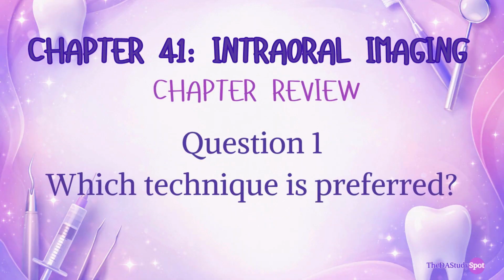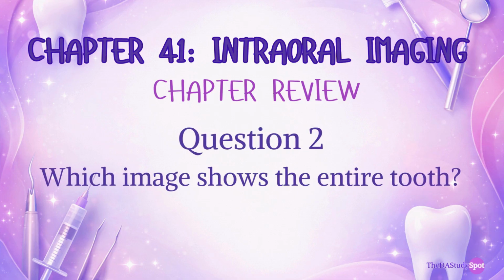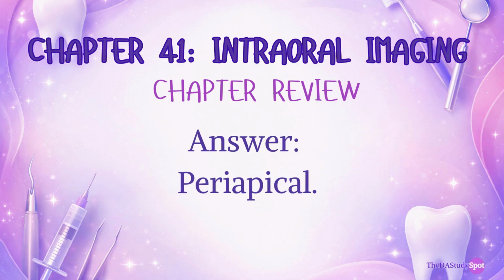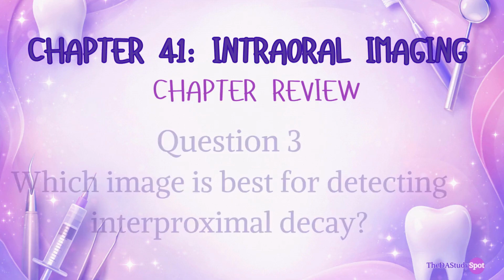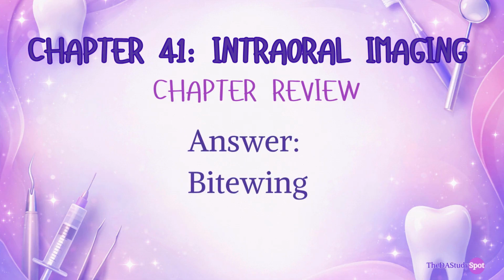Question 1. Which technique is preferred? The paralleling technique. Good. Question 2. Which image shows the entire tooth? The answer, periapical. Amazing. Question 3. Which image is best for detecting interproximal decay? You got it, Bitewing.